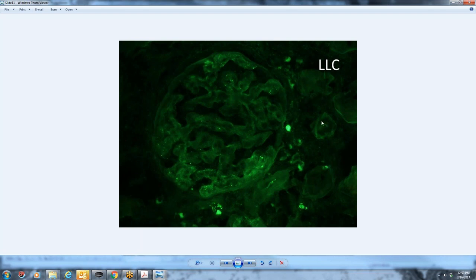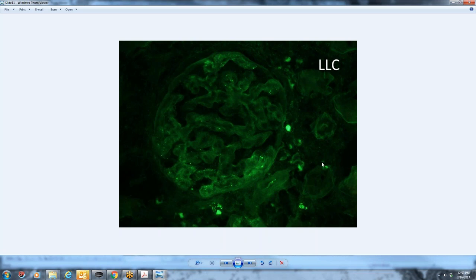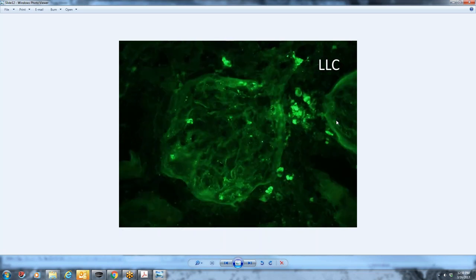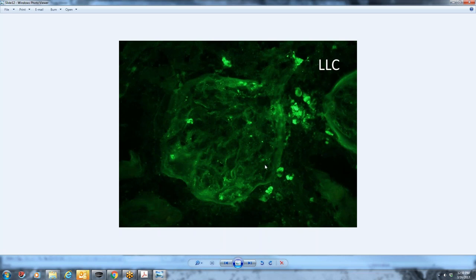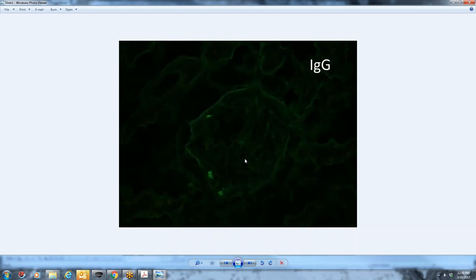And in some areas it gets quite chunky. So there is C3 activation. And that might be part of the reason we have this proliferative component for the glomerular disease. But that's the only one that's kind of staining strongly. Kappa is negative. And the lambda is almost just glowing and everything is kind of glowing on the lambda stain. So it fit more with just kind of background stain. These guys are plasma cells. And the fact that the plasma cells are staining stronger than the glomerulus makes me attribute a lot of this to the background.